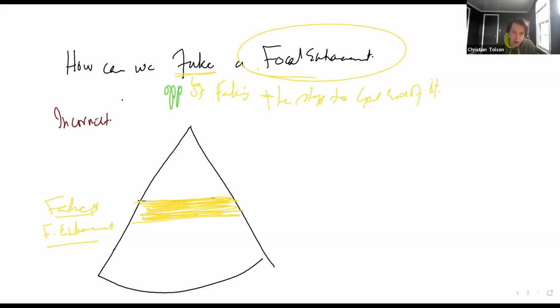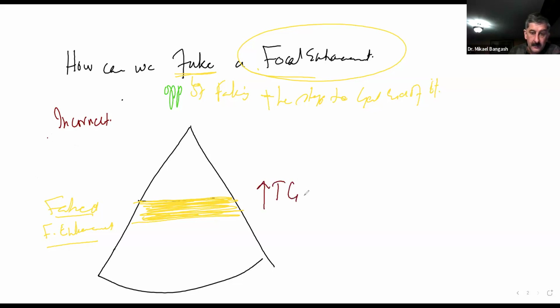If you have it too high in shallow depths. Exactly. If you falsely, for instance, increased the time gain compensation at this point here, what would that do? That would mainly cause the intensity of the reflections that were reflected from this depth here to be falsely overcompensated. And that's why you have this.